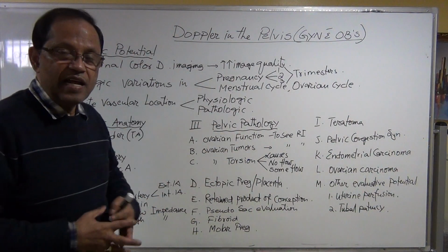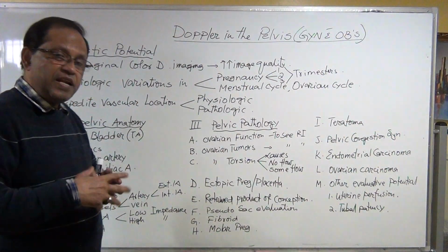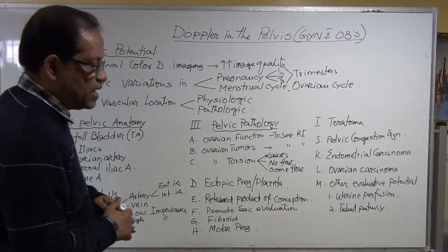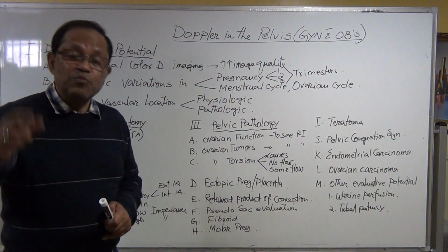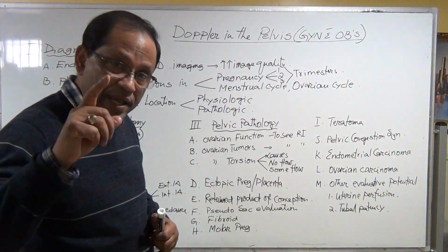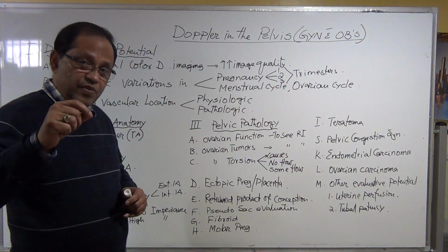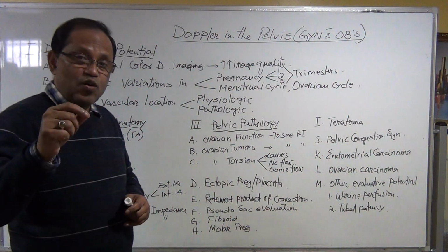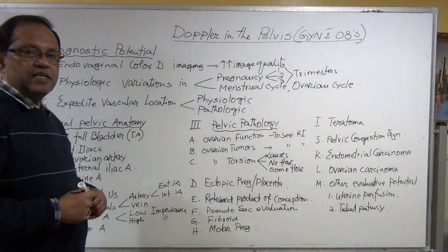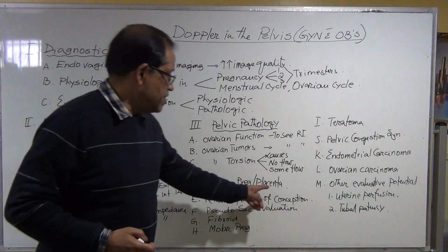When we click the color, we see more vascularity there than in the other parts of the uterus, so we figure out that this is a placenta. Moreover, we can see the umbilical cord at 8 to 9 weeks. We can see the placental end of the umbilical cord, and if you click color, you can see the color flow. Okay, so it can be very helpful.